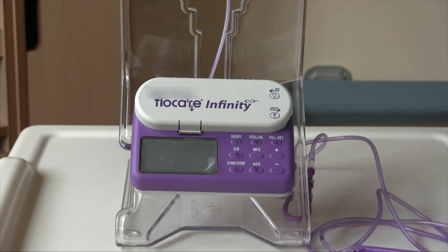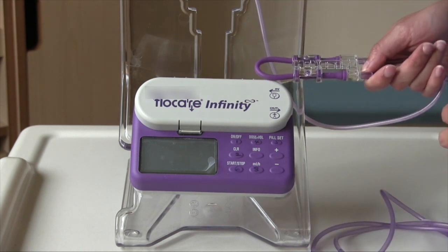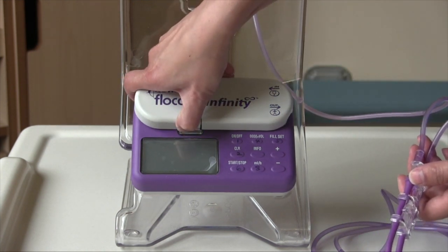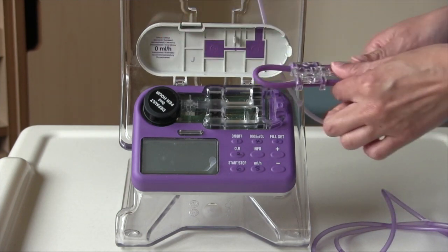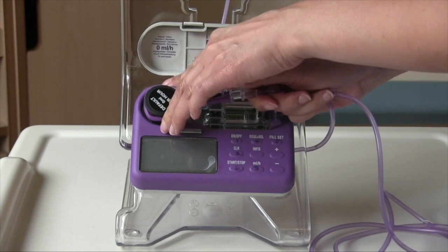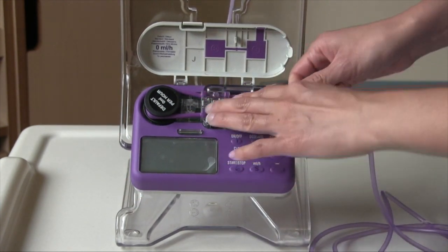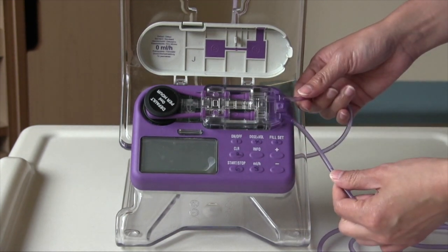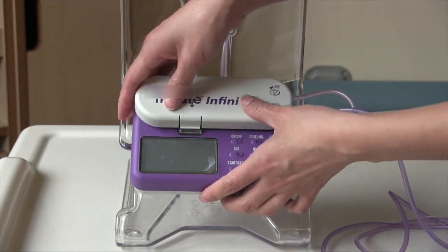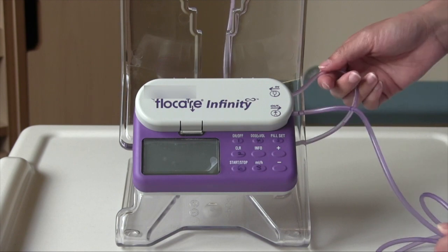After you have hung your feed on the stand, we will now put the giving set into the pump. To open the door, place your finger in between these two lines, press in and lift. You'll loop the purple tube just over the black circle, and you'll just pull and place that part of the tube in, making sure that none of the tube is kinked. Then you'll simply press down on the door until you hear a click, and then you have the giving set in your pump.